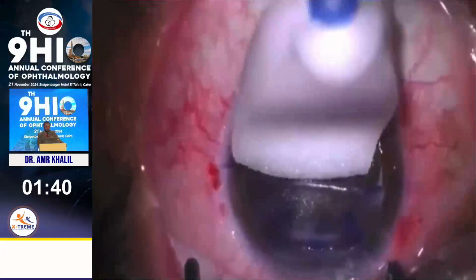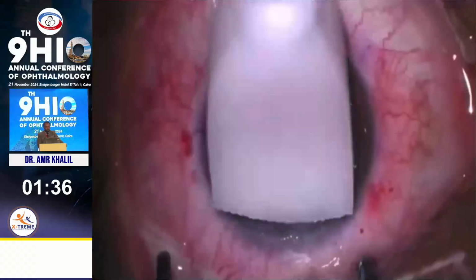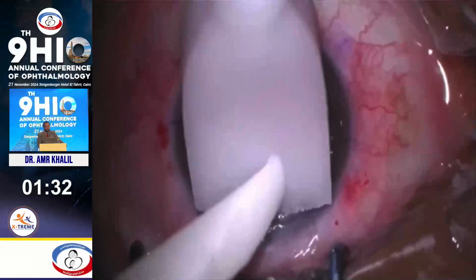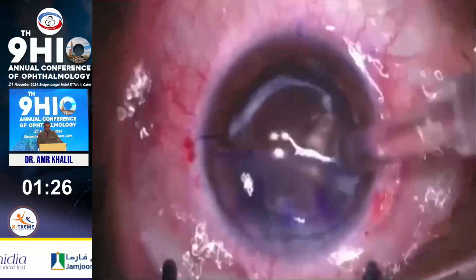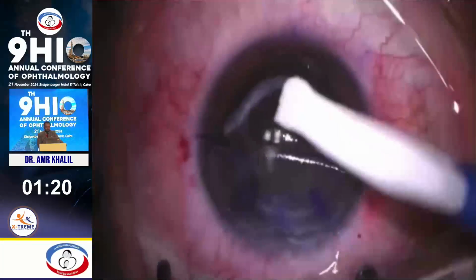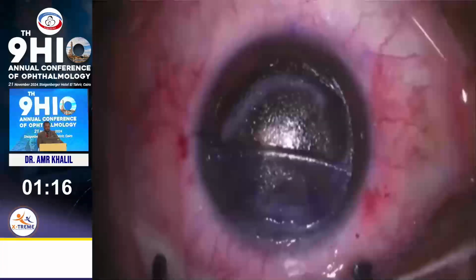Now I'm applying 70% alcohol for 15 seconds, followed by mitomycin C 0.02% for another 15 seconds. Then copious irrigation; irrigate and irrigate again. Then dry the stromal bed and the posterior surface of the flap.